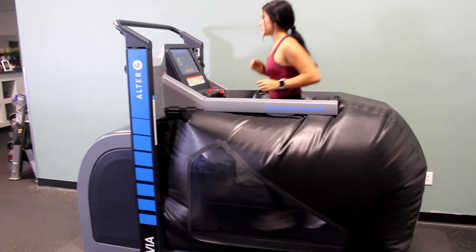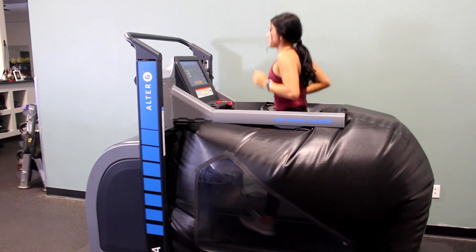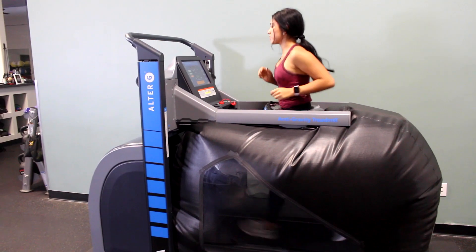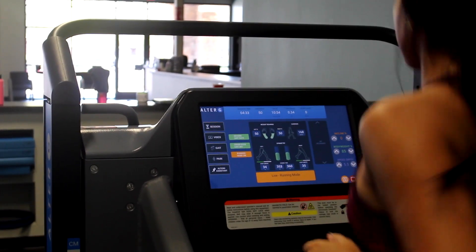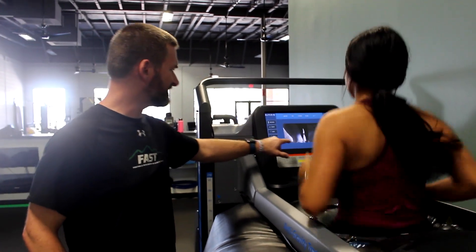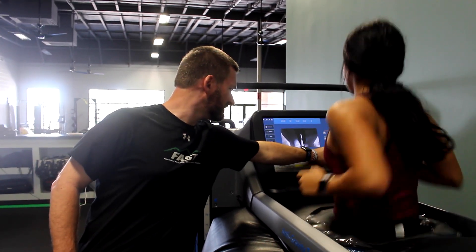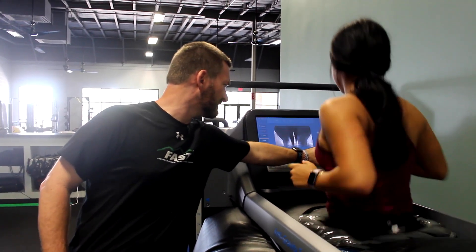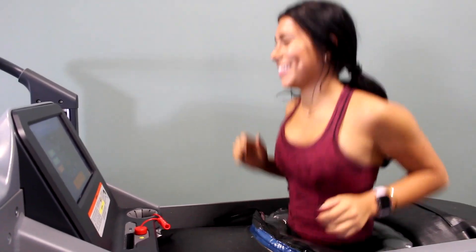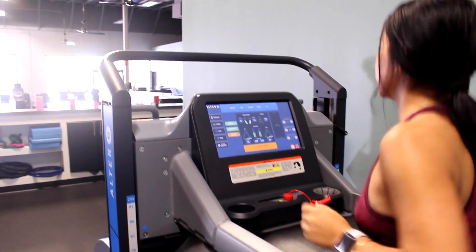Elite and recreational athletes love using the Alter-G to recover from injury without losing their fitness. While running, you will receive real-time video feedback to analyze your gait and allow you and your therapist or coach to work together to improve your form as you are running. This instant feedback increases your ability to adopt the feedback in the moment.